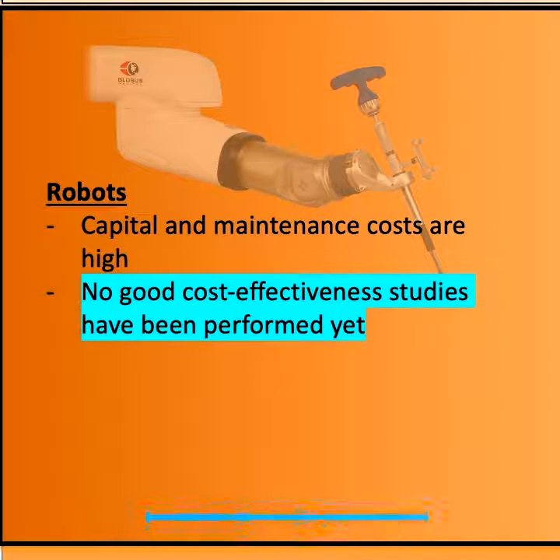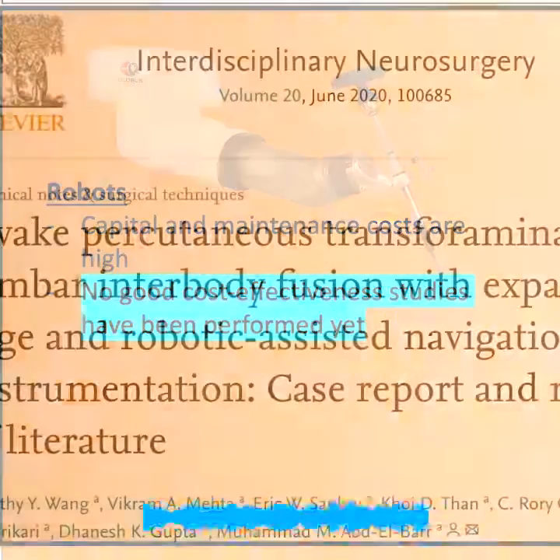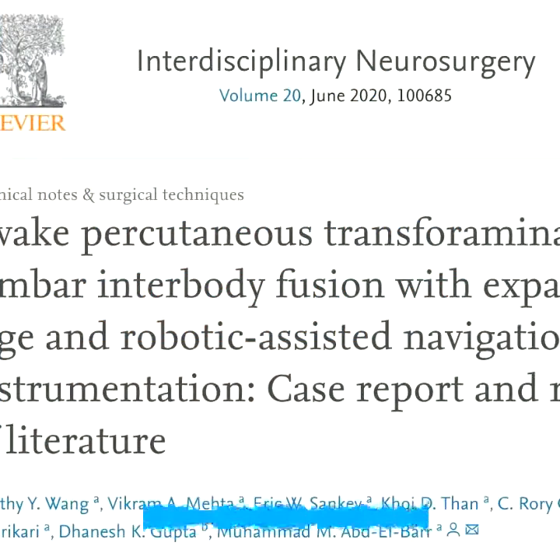There is one company that has integrated augmented reality into surgical navigation so that surgeons can see the patient's real-time anatomy from a preoperative CT while they are performing surgery. This certainly will help improve the safety of spine surgery. I was recently asked during the panel discussion in India if there is a role for robotic surgery while the patient is awake. There have been a few case reports of surgeons across the world who have demonstrated the role of robots for awake spine surgery.